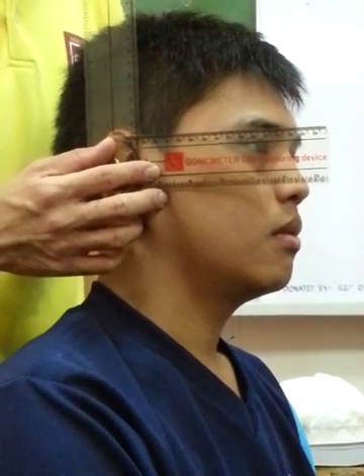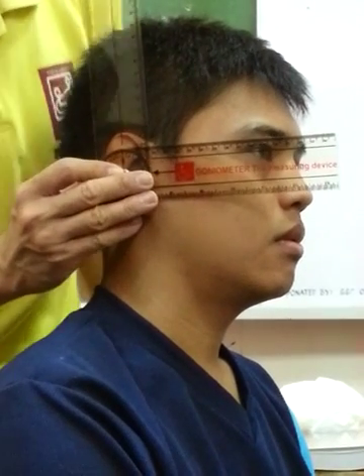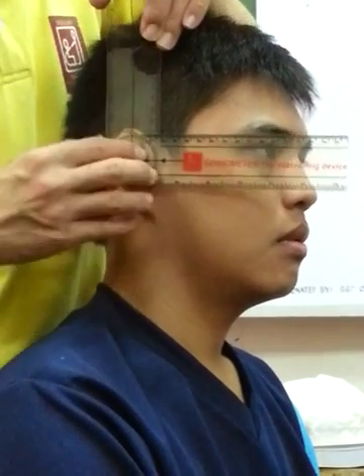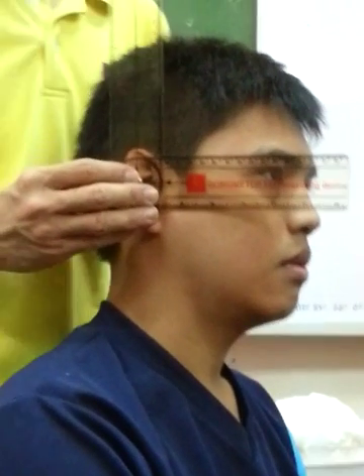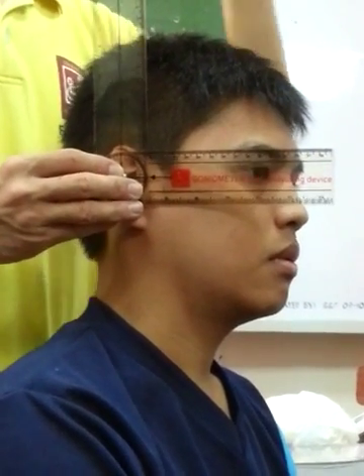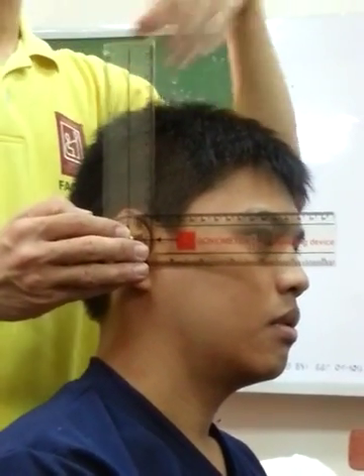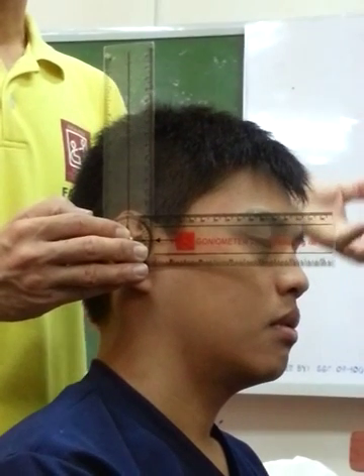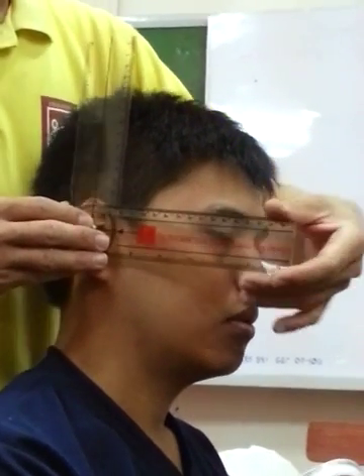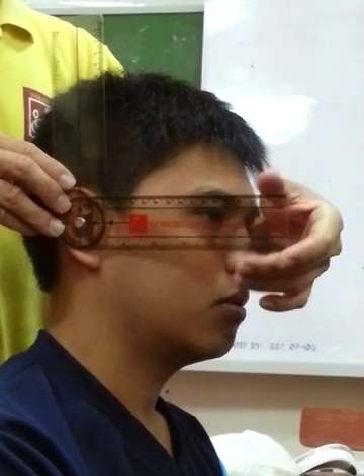When measuring with the patient, you're not going to tell the patient where the fulcrum is aligned or that the proximal arm is in position — you don't have to say that to the patient. But in the practical assessment for the faculty, you have to verbalize where each part is aligned. It's not part of what you say to the patient.